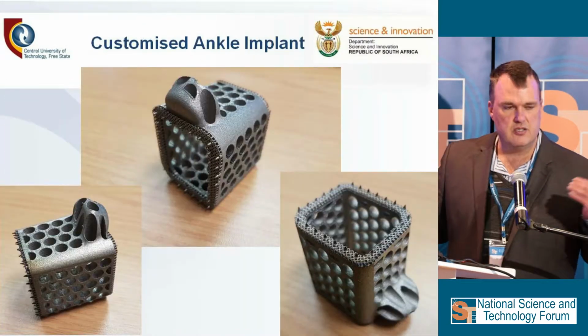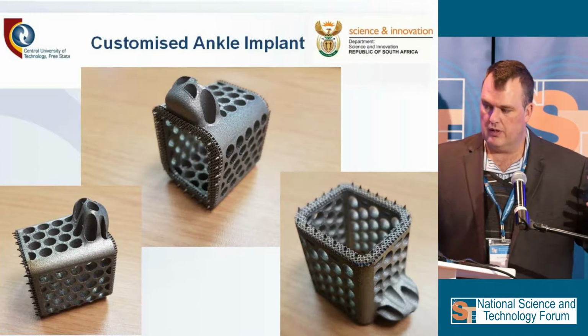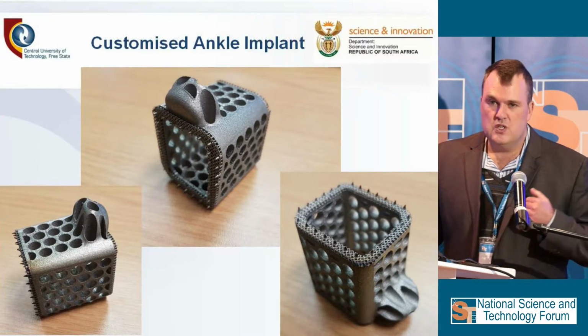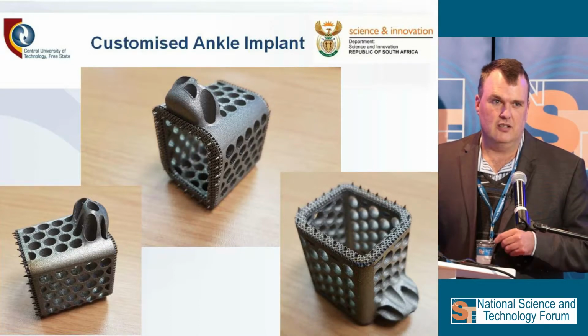You will see here the osseointegration, the two surfaces, where you want very fine pins where the bone attaches. This is an ankle implant that was tested. It was implanted. I will get quickly to the regulatory side and our ISO.